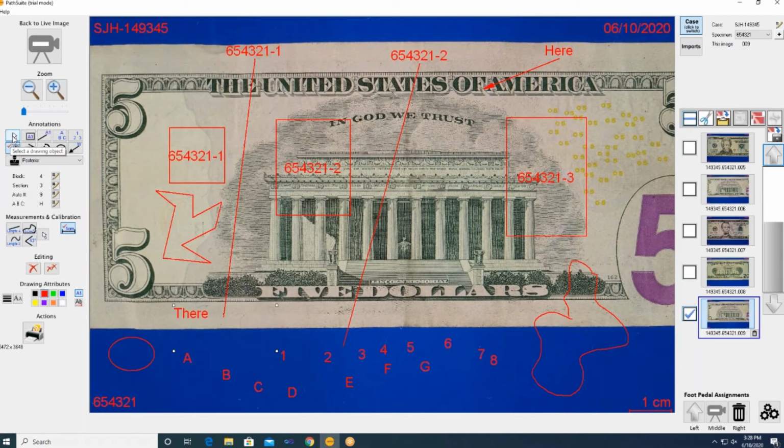Also, what's interesting here is that I can go in, because I hate typing, I'm an engineer and I usually type everything wrong. We have what's called the text stamp. And when we click on that one, it gives you basically a list that you can enter the names in of anything. And so let's say here's inferior, and then let's do anterior. Here's ER, HER2 is in there. So we can have basically all of my favorite words in there.